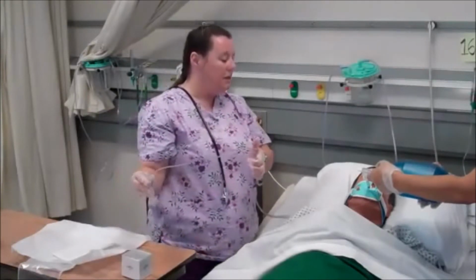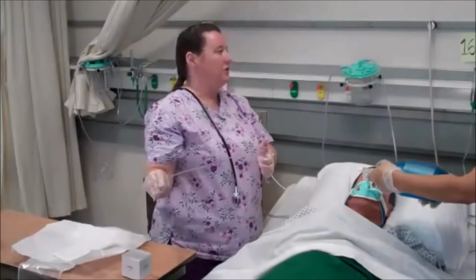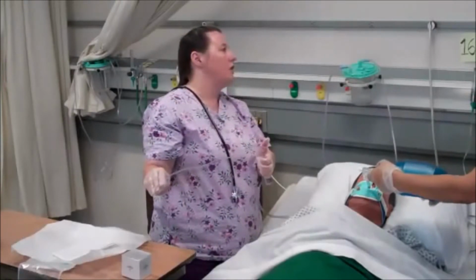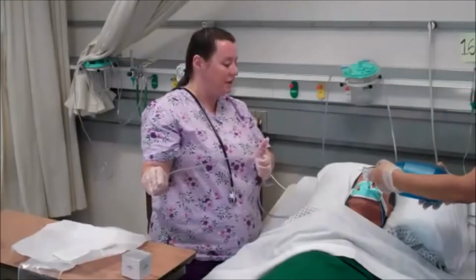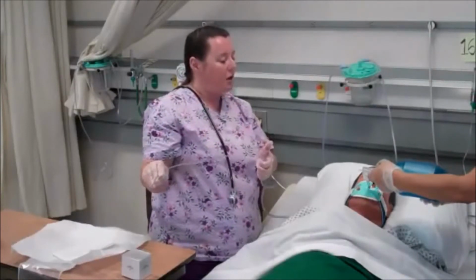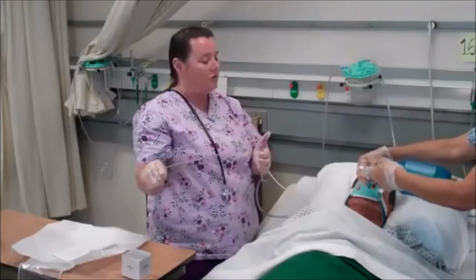I see that he appears to be breathing easier, less agitation. Looking at the monitor, his O2 sat has returned to baseline now. Heart rate has come back to a baseline level now. And Kathleen can go ahead and put the patient back on the ventilator source.